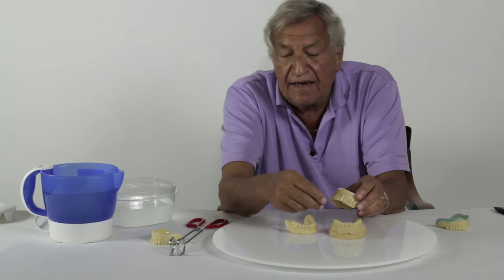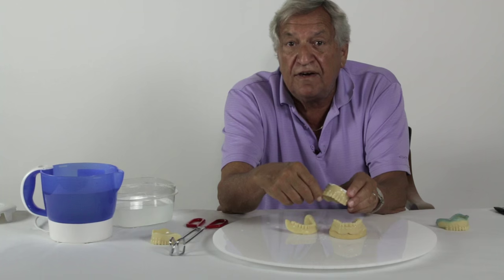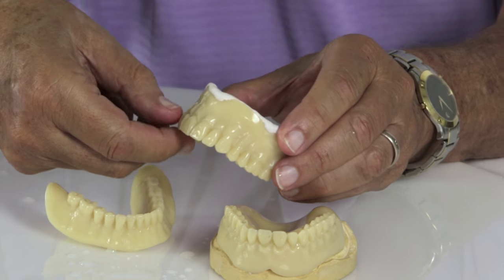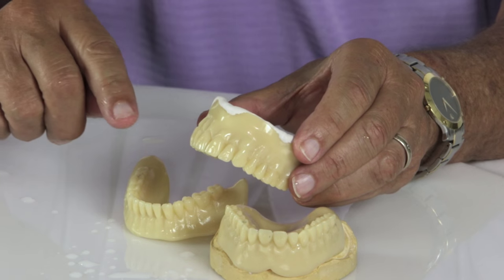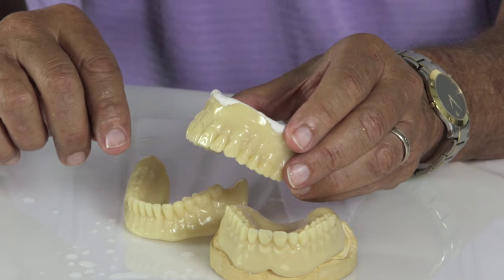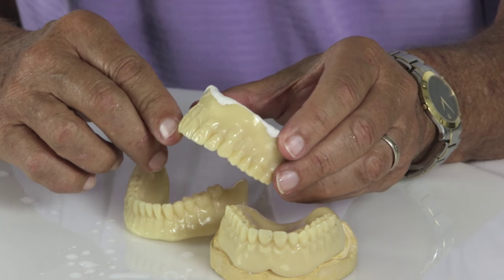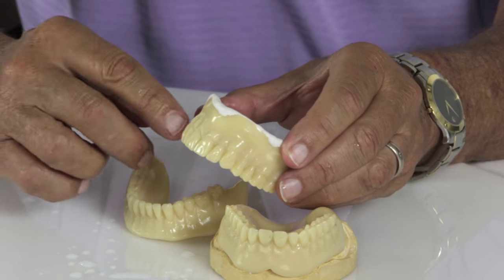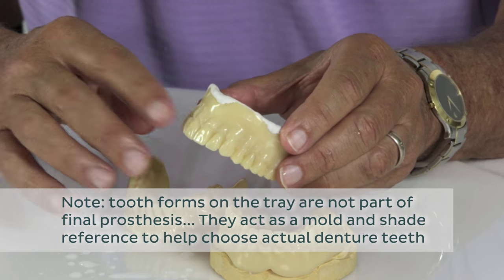Once he's done that, he stays in the mouth and does what we call a three-dimensional tooth selection. He works with the patient and shows the tooth forms. These are in Vita shade — this is a Vita shade A2. The patient gets to see the shade and the mold. If they want to change the mold, we give them the dimensions so that he can pick any mold from any tooth manufacturer. The tray is not generic to the tooth mold.